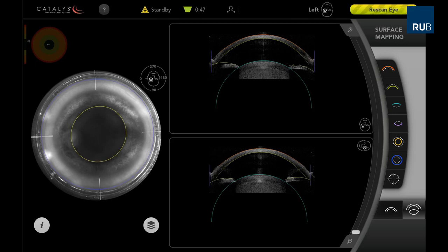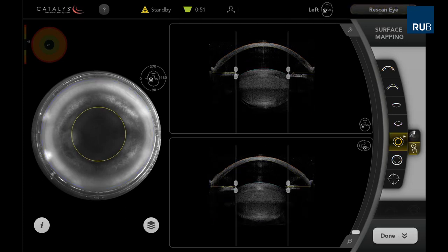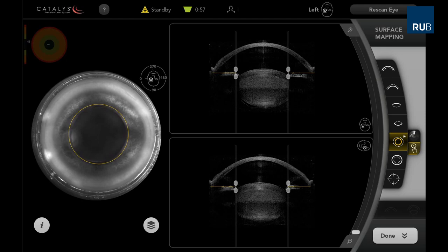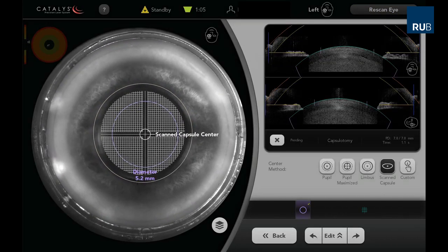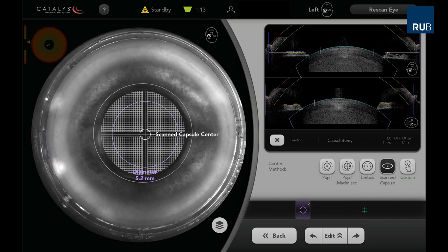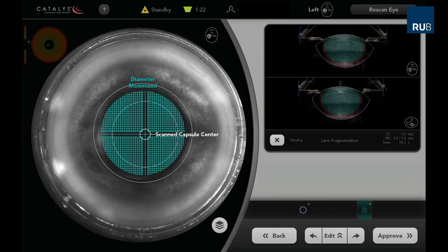In this video, we perform laser-assisted cataract surgery in a myopic brunescent cataract with loose zonules. After non-applanating docking, the anterior segment of the eye is visualised by the integrated 3D spectral domain OCT. The capsulotomy diameter is set to 5.2mm and the grid spacing of the fragmentation pattern is decreased to 100 micrometres.